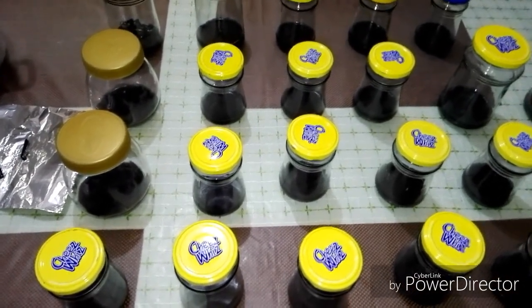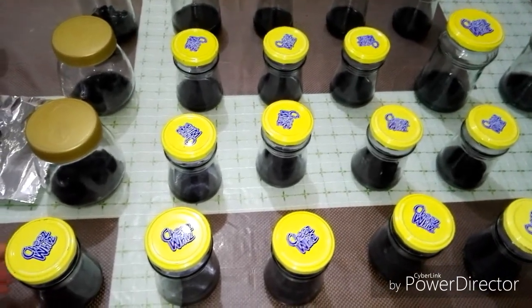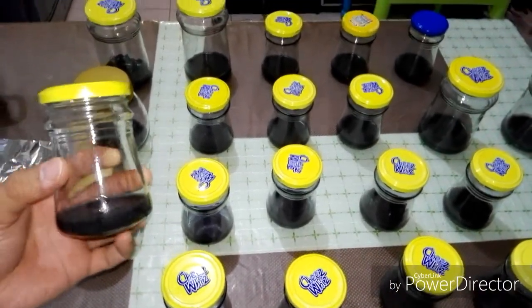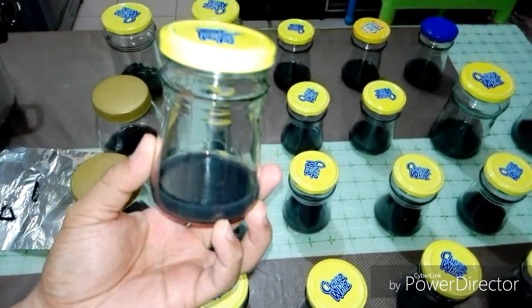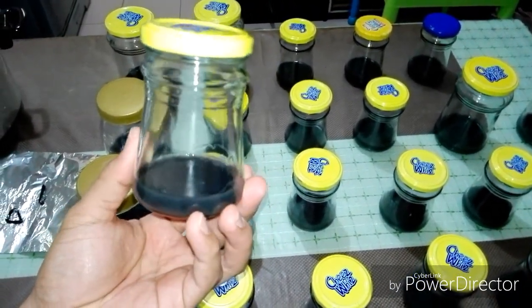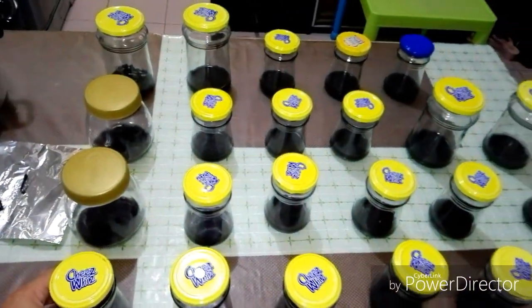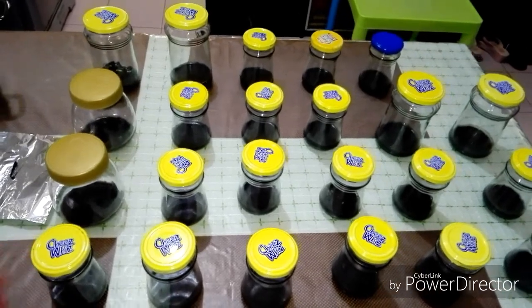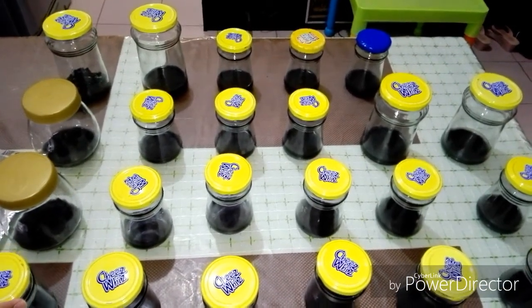Hello guys, this is Ryan of My Mixed Videos Philippines. Today I have finished making my third batch of nutrient medium for orchid seeds flasking. I have made 23 flasks and it is now ready for sterilization.